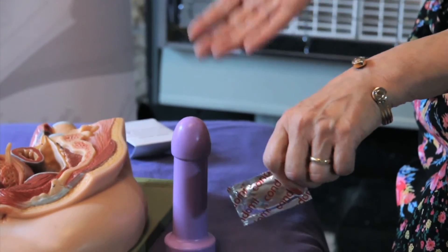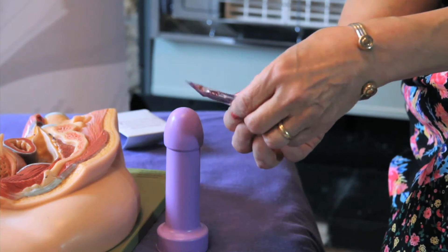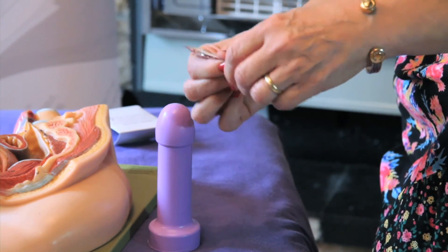The most important thing about using male condoms is that the man has to have an erection when the condom is being used. Without an erection, the condom can twist, fall off, and provide very limited protection. We'll squeeze the condom to one side of the packet to make sure that when we rip it open we don't rip the condom.